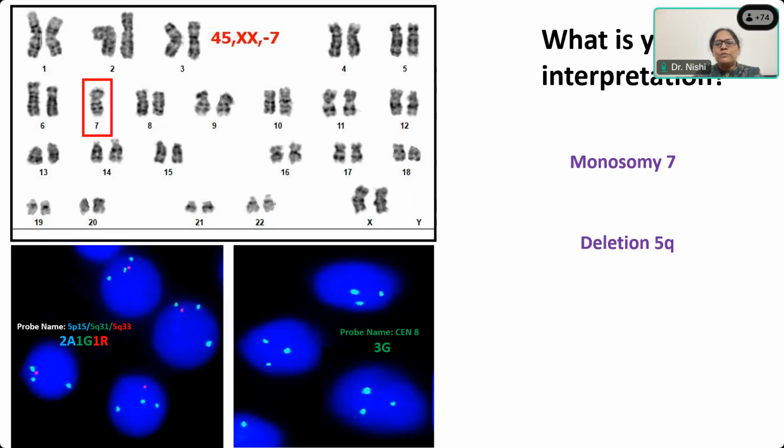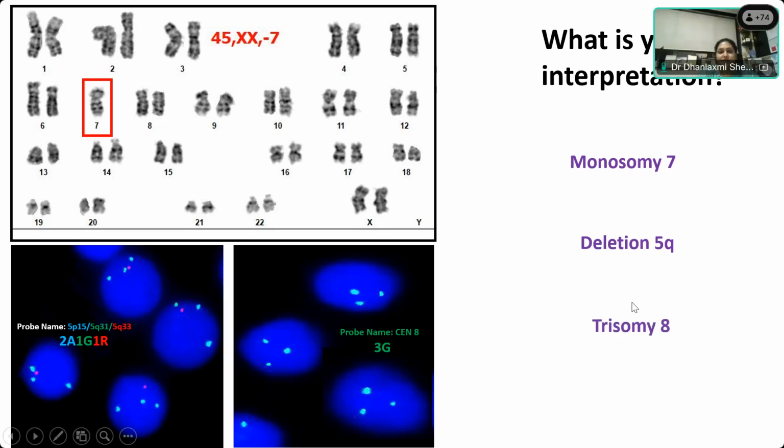Answers are coming, ma'am. Most of them have answered trisomy 8. Yes, they are right. It's not monosomy 8, it is trisomy. You have got 3 signals, right? Now, could the audience also tell me what could be the disease where all of these abnormalities could be found? Monosomy 7, MDS, very good. Yes, the audience is answering. Someone has answered ALL probably also. I could ask some difficult questions here. Wonderful.